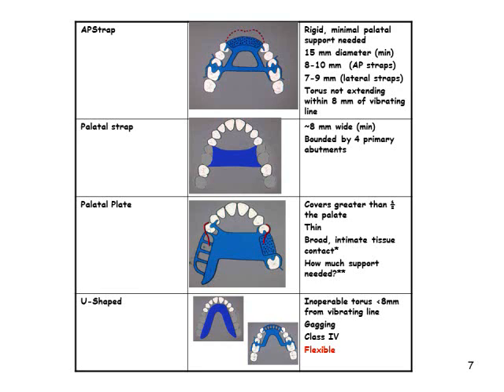The lateral palatal straps are 7 to 9 mm wide and parallel to the curve of the arch, a minimum of 6 mm away from gingival crevices of remaining teeth. The anterior palatal strap anterior border is not placed farther anteriorly than anterior rests and never closer than 6 mm to lingual gingival crevices. It follows the valleys of the rugae at right angles to the median palatal suture.